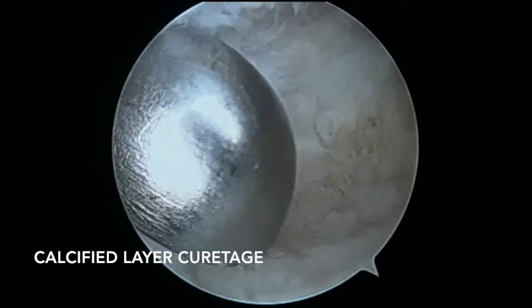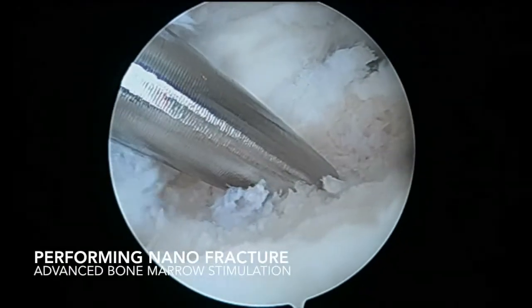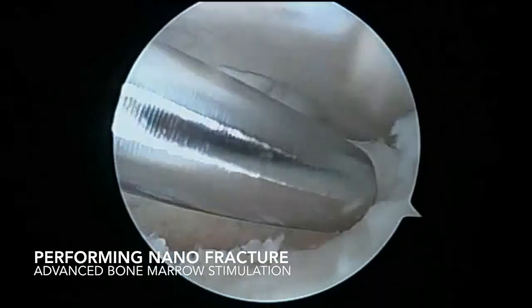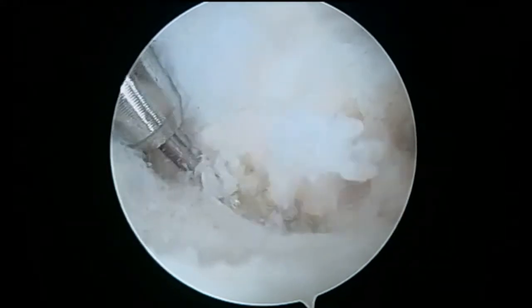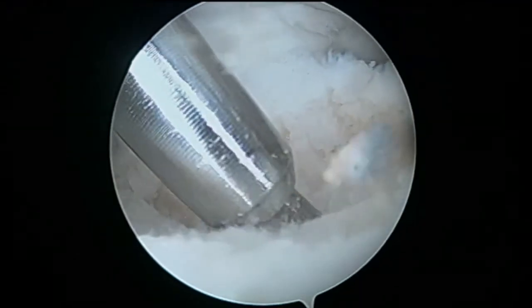Next step, we use an advanced less invasive bone marrow stimulation technique: the nanofracture. This technique allows us to perform deeper 9 mm but smaller in diameter 1 mm holes, compared to standard microfracture techniques. The objective is to increase the recruitment and produce less damage in the subchondral bone.